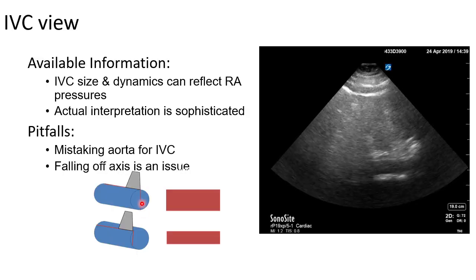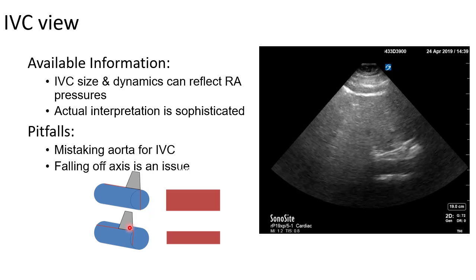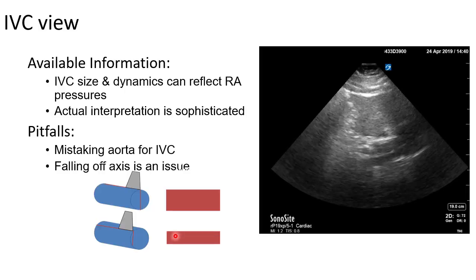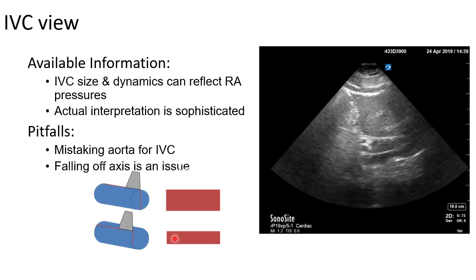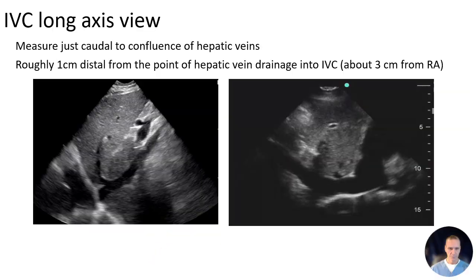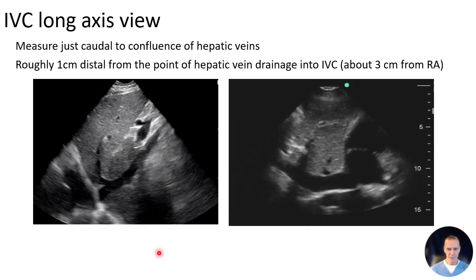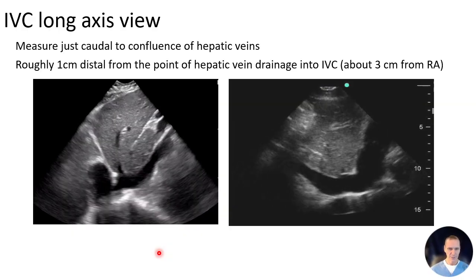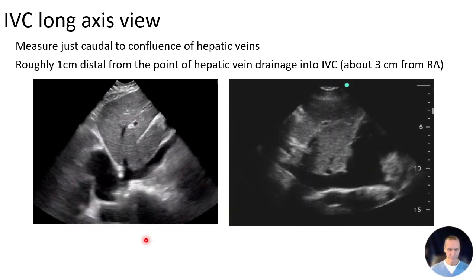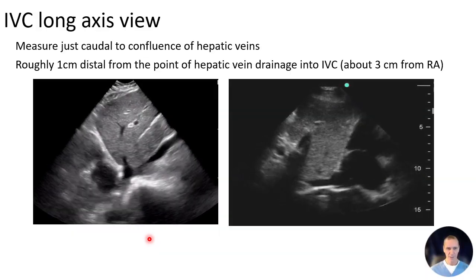So look at this cut, it is right on the center of the IVC. The IVC looks larger. If your probe is just over a couple millimeters, the IVC size is going to decrease quite substantially, and your variation will also change quite substantially. So you likely will see different providers imaging the IVC at various planes. The heart is always done the same way, standard.